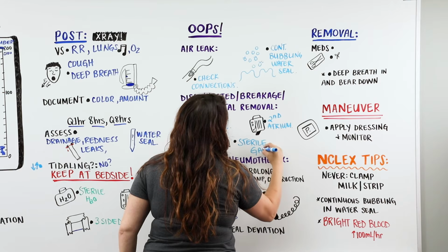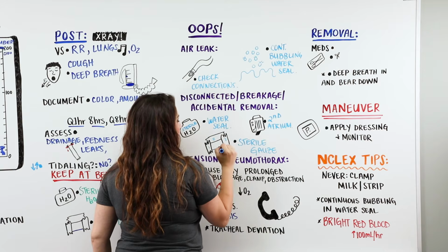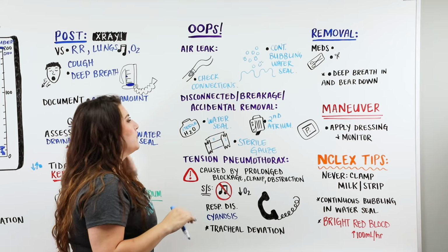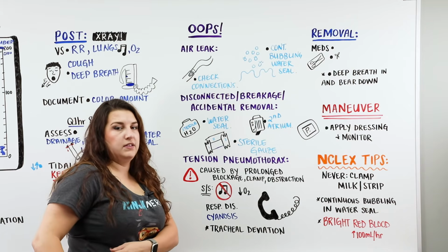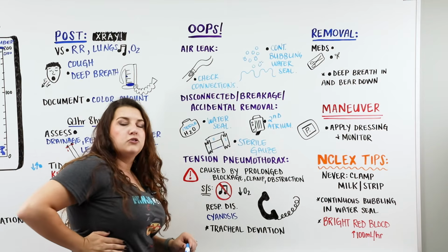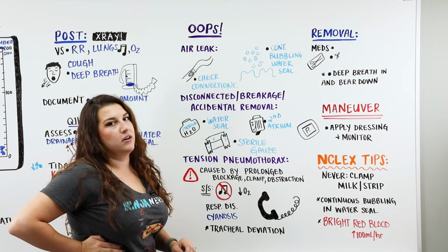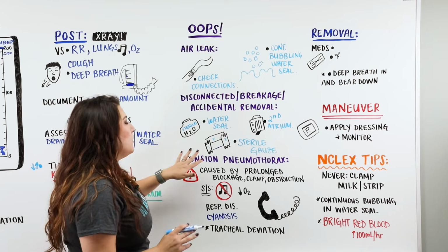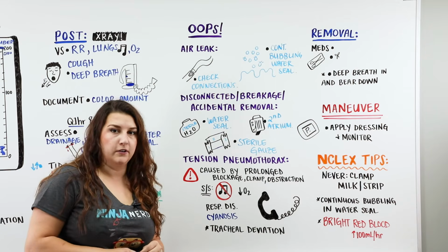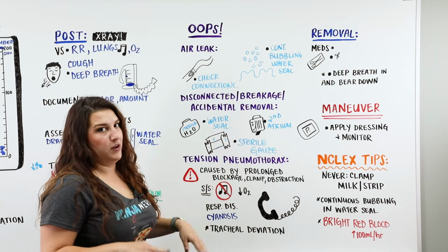So what we're looking at here is our sterile gauze, 3-sided. So we have 1, 2, 3 sides of tape, and then this side open, which is a flap. And we use this in case the patient has completely removed their chest tube and they just have this gaping open wound here. What we're going to do is we're going to take that and put that right over. So when they exhale, it's going to release that air out, but when they inhale, they're not going to pull air into that pleural space. Good thing is if the patient is up for removal soon and they accidentally remove it themselves, there may be a point where you can just put on a better dressing and move from there.